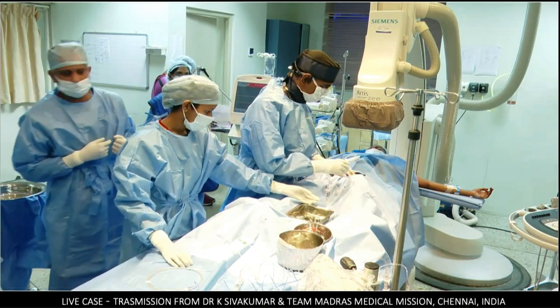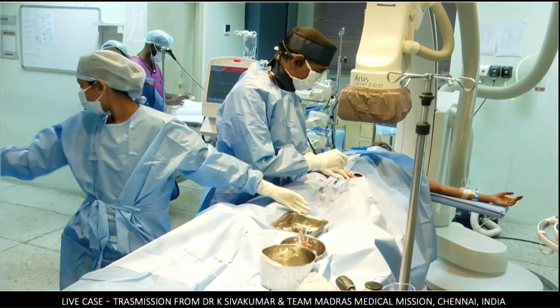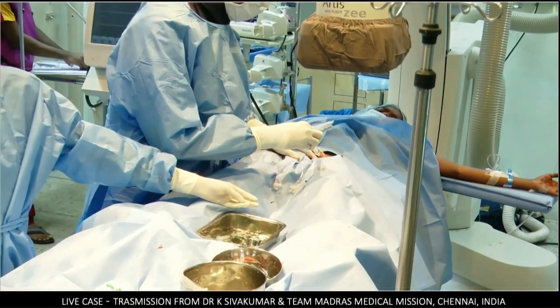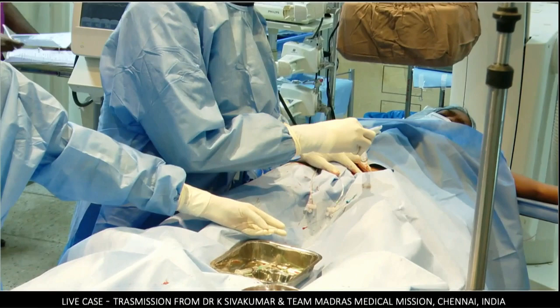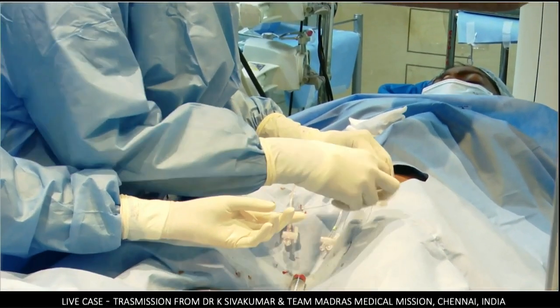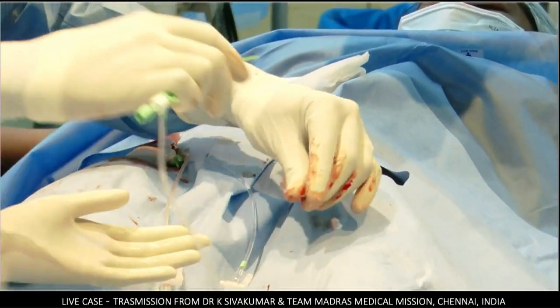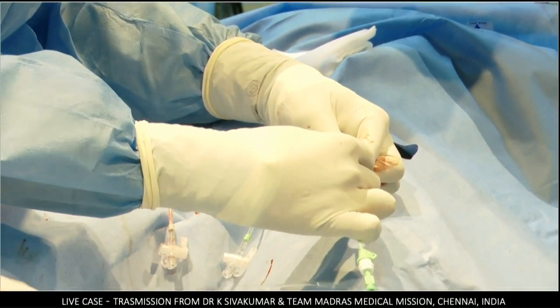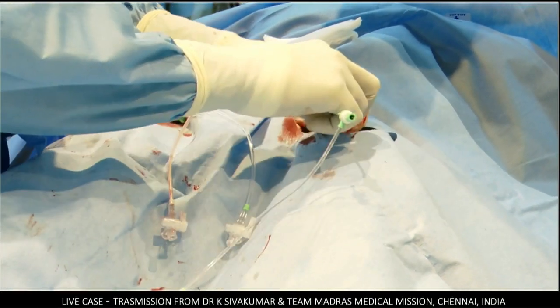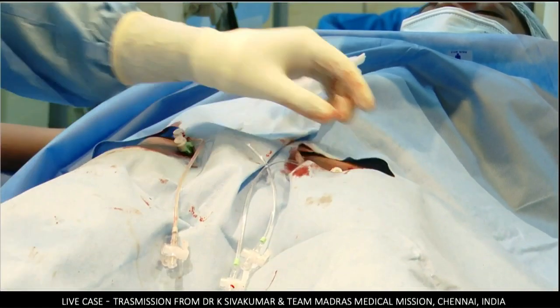We don't have nitric oxide, so we have no choice but to use 100% oxygen. What is surprising here, Shiva, if you can hear me, it's Masood Sadiq here. If you look at your pressures, your diastolic pressure hasn't come down. Your mean pressure hasn't come down. But your Qp:Qs and your measurements, whatever it means, show that your PVR has dropped. It's really hard to believe because if your pulmonary artery pressures were not dropping at all, including mean and diastolic pressures, it's hard to believe that you actually had a reversibility or reactivity.